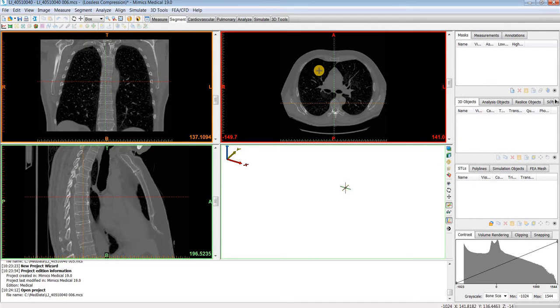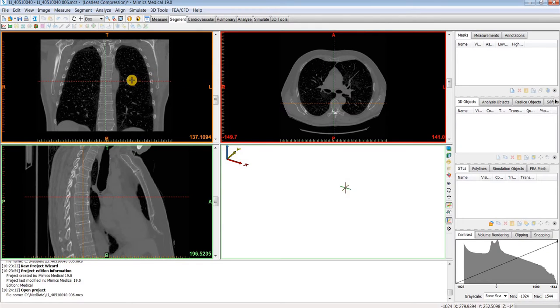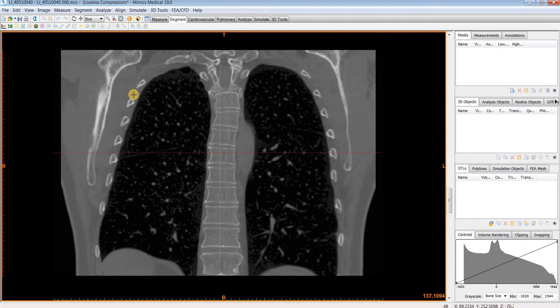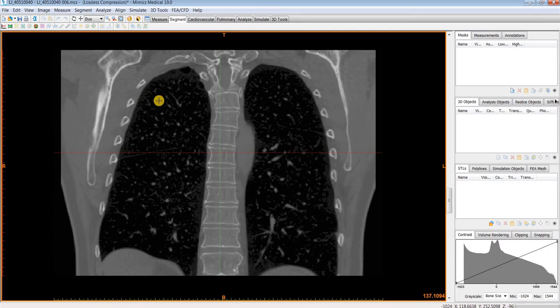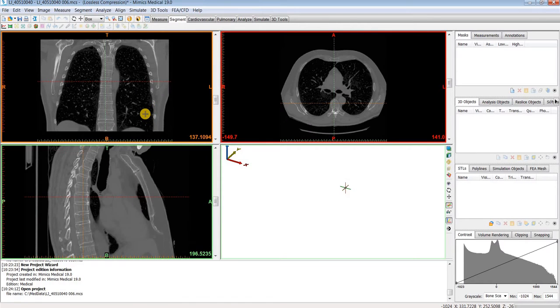If you'd like to bring up any of these screens full screen, you can put your cursor over it and hit the space bar and that will bring up that plane full screen.